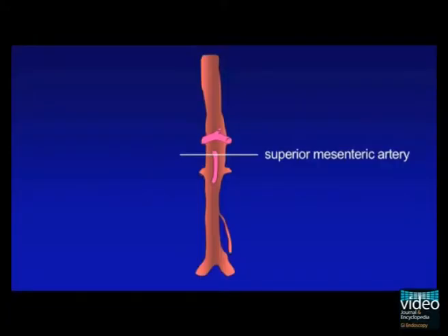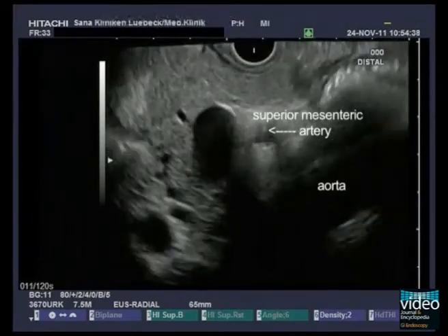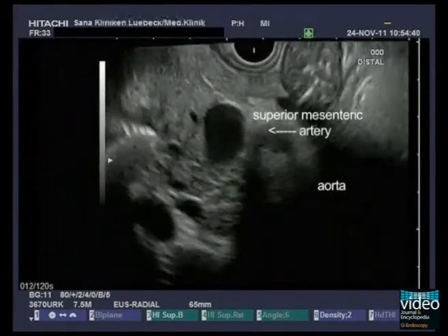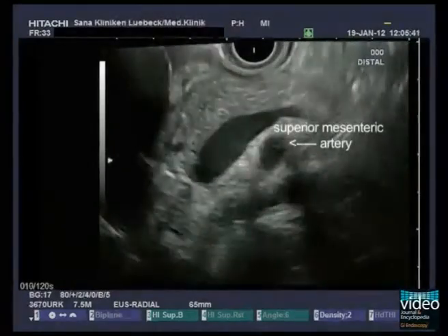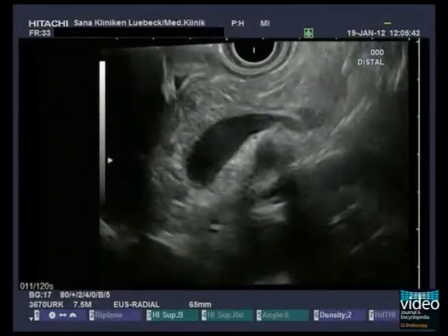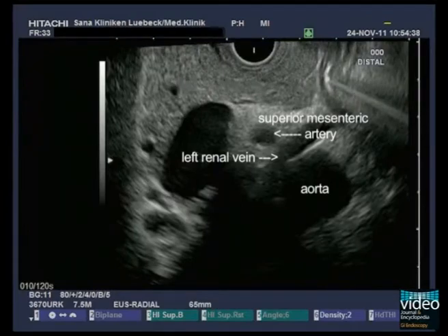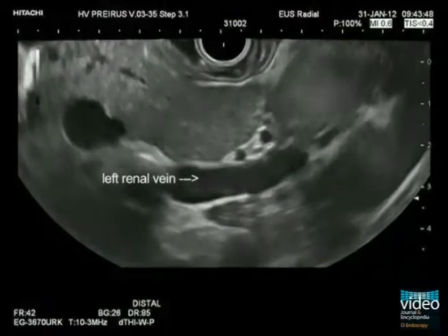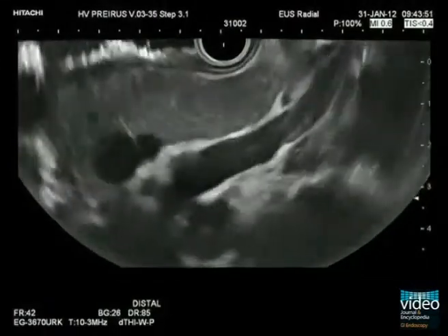A few millimeters caudally, the origin of the superior mesenteric artery can be shown in cross-section in front of the aorta. In between the superior mesenteric artery and the ventral wall of the aorta, the crossing left renal vein is in sight.